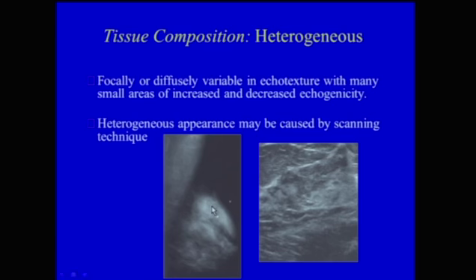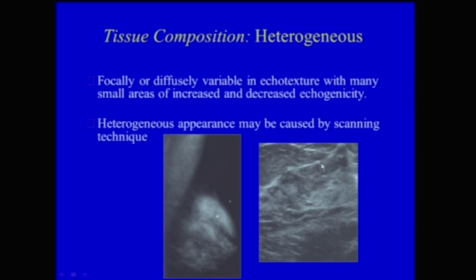Or we could describe the tissue as heterogeneous — either focally or diffusely variable in echotexture with many small areas of increased and decreased echogenicity. On the mammogram mediolateral oblique projection, you can see a heterogeneous breast density with areas of fibroglandular tissue and areas of fat, corresponding with the adjacent ultrasound showing subcutaneous fat and an area of echogenic tissue with hypoechoic areas of fat within the fibroglandular tissue.